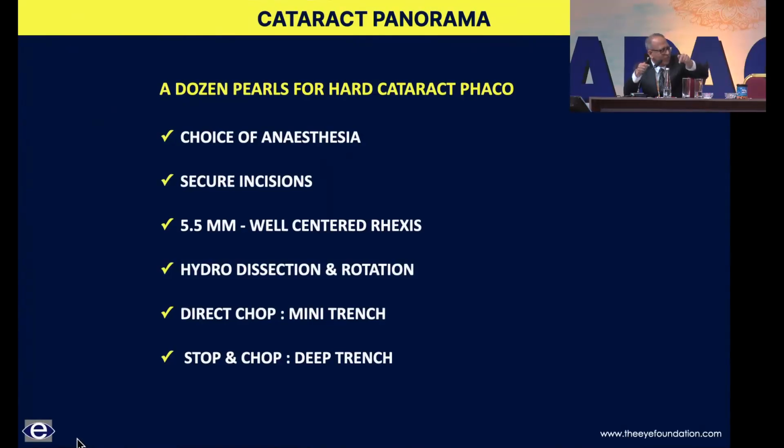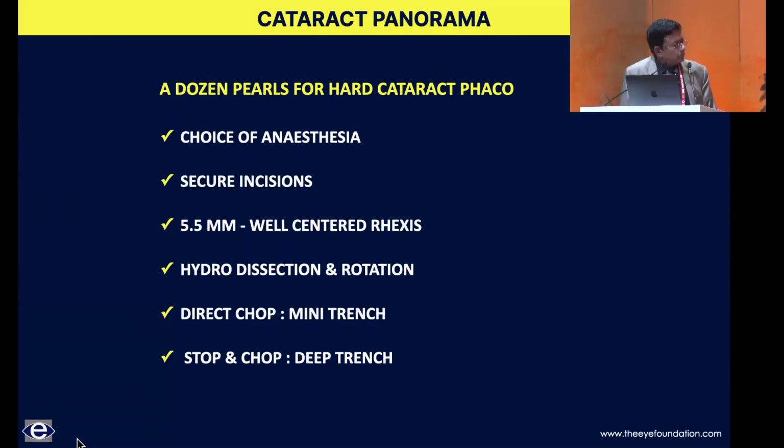It just incises it. And when I'm chopping it, I don't do it fast. What I've realized is that if you move it slowly towards the chopper, towards the phaco tip, it separates in a better way. If you make it fast, somehow... try it out, do it at your routine speed, and then do it slightly slowly, and you will find that it separates more. Maybe because you are trying to tell the tissues to separate, something like that. David: Yeah, I think that's a really subtle but good point.